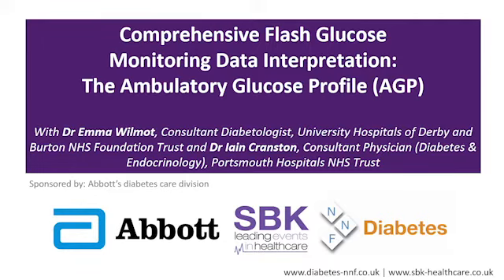The difference, of course, is that that's always going to be a moving feast, depending upon what your average glucose level is. And so for me, visually, just seeing how wide the profile is is actually a more useful measure. My visual cue, which I use probably more often than the percentage CV, is this: if I'm looking at the AGP projection and I can see what the target range was, and I can see that the AGP projection is significantly wider than the target range at any point of the day, I know that the variability at that time of the day is potentially going to be a problem. So what we're basically saying is that snakes trump coefficient of variation.